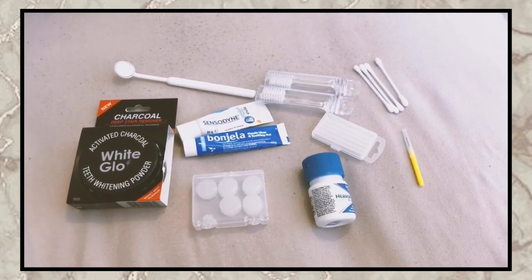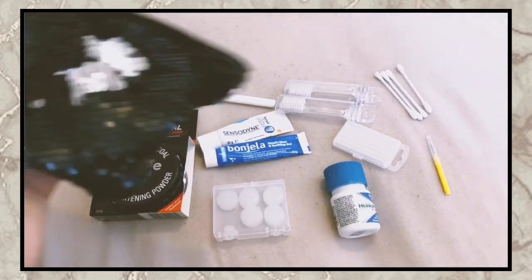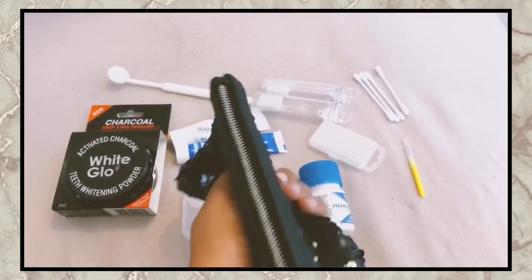I'll show you guys what I've put together in my little travel bag that I carry things in that I need. These are the things that I put in this little travel case.